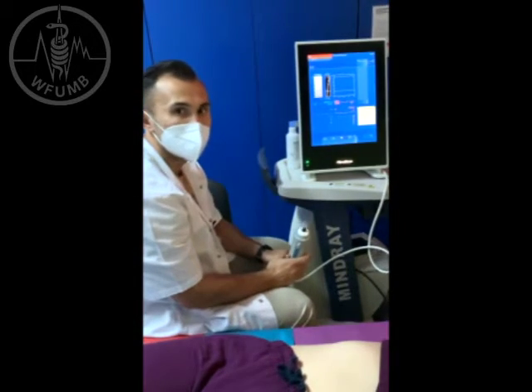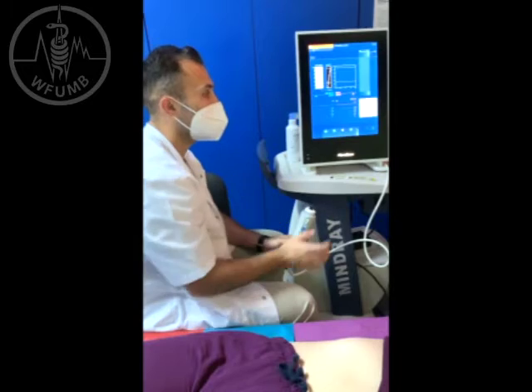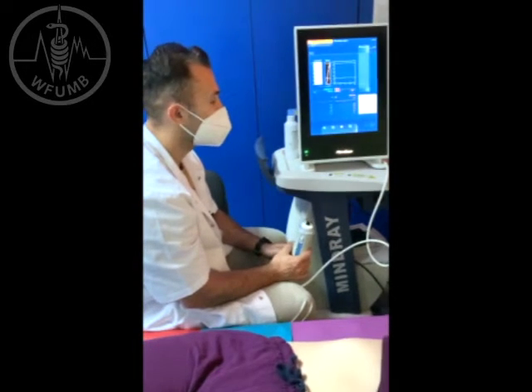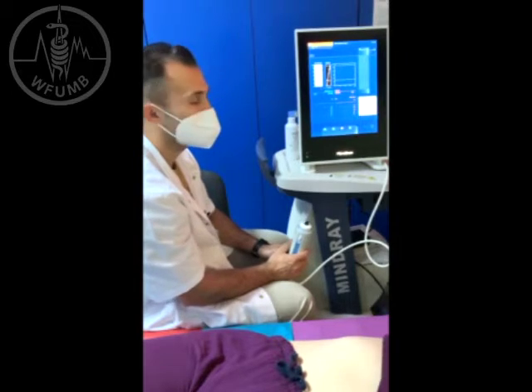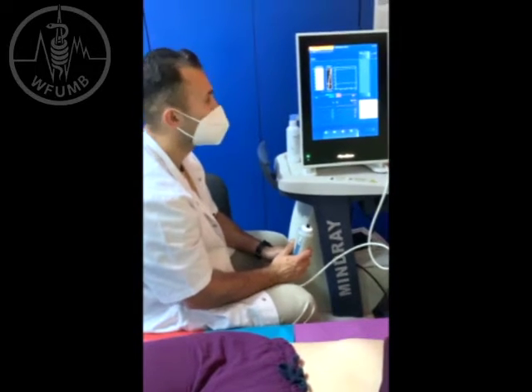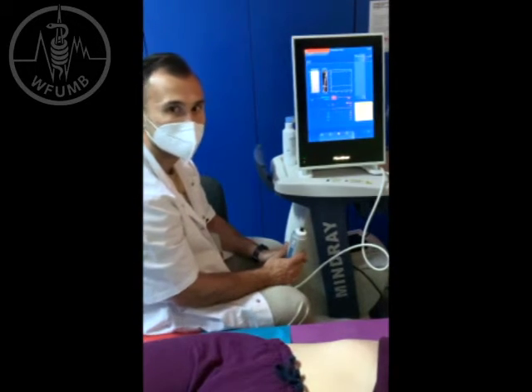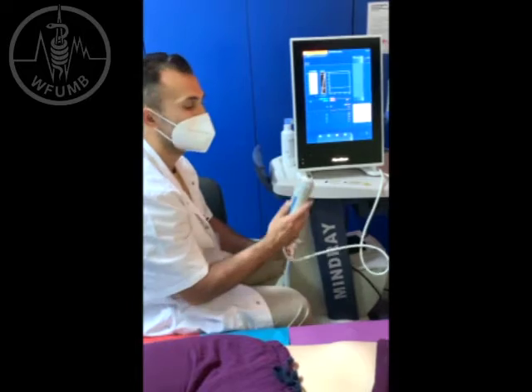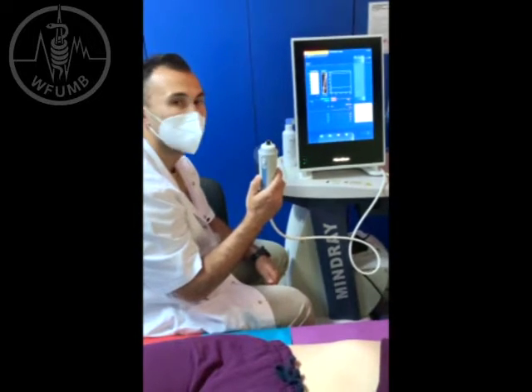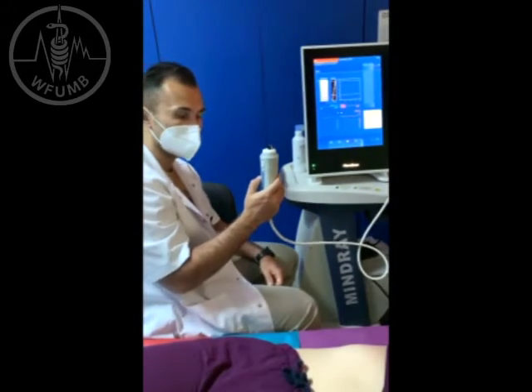I usually calculate the BMI of the patient. With this system, we also have an automatic probe selection tool which guides us in choosing the correct probe based on the patient. I usually start in patients with BMI below 30 the examination using the M probe. If, for example, I don't obtain 5 consecutive valid measurements, then I switch to the XL probe.